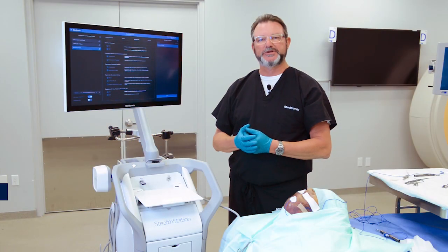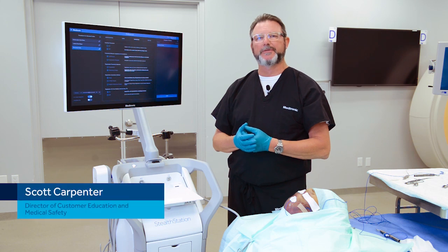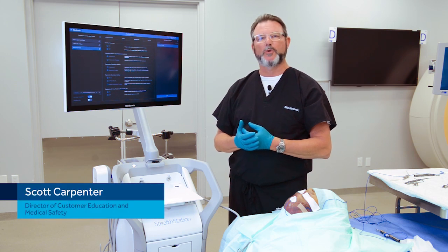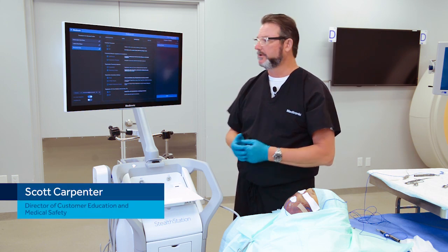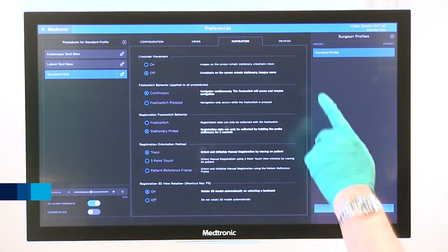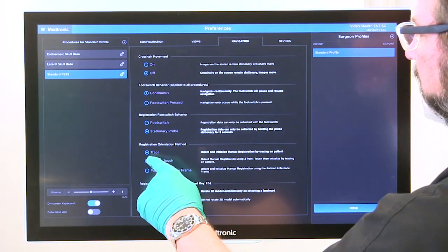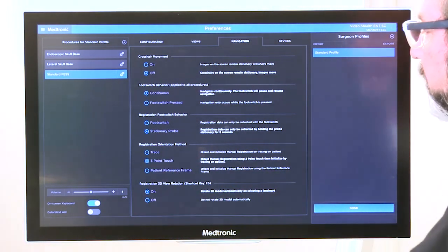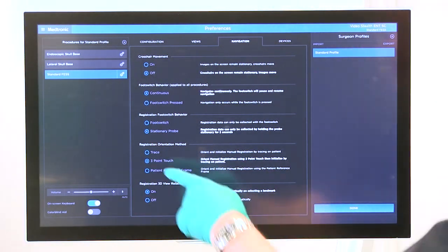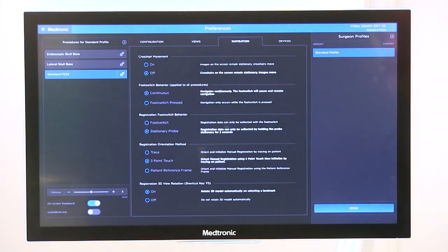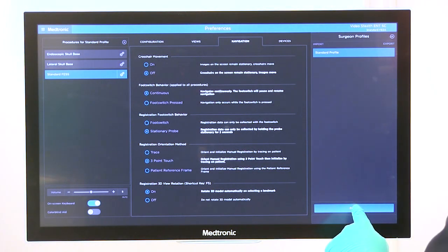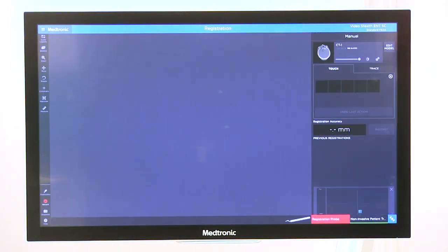The next patient orientation method I'd like to talk about is called three-point touch. To select that, go to your surgeon admin panel, select three-point touch under your registration orientation method, and hit done.